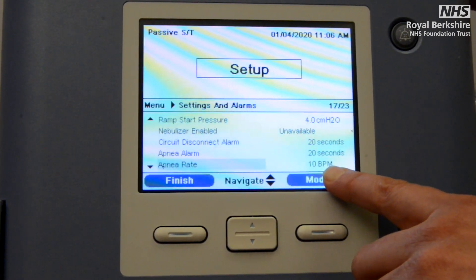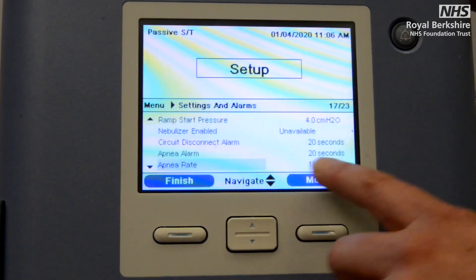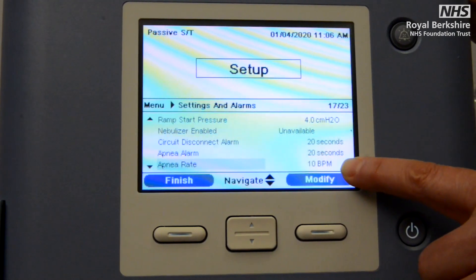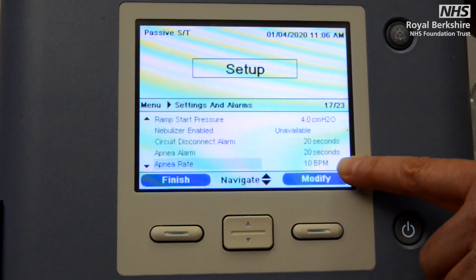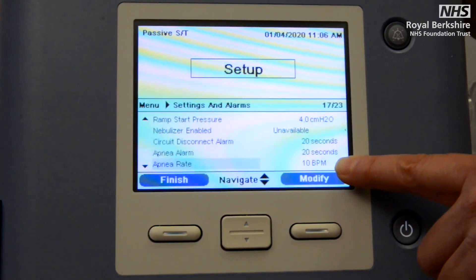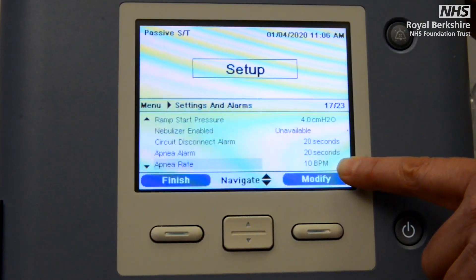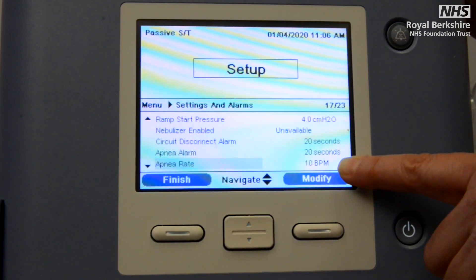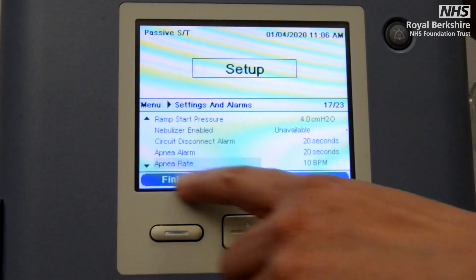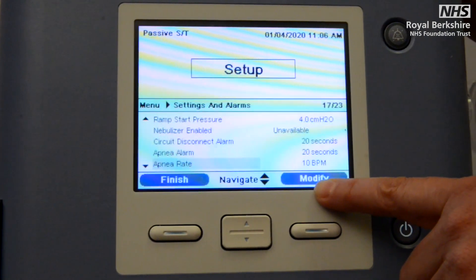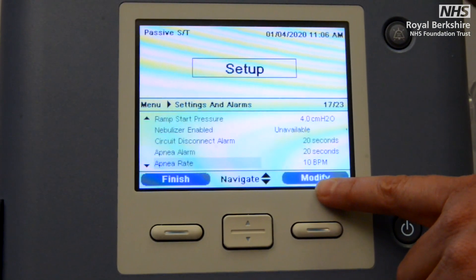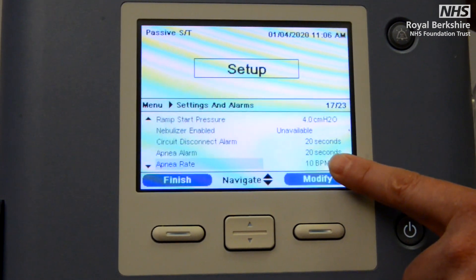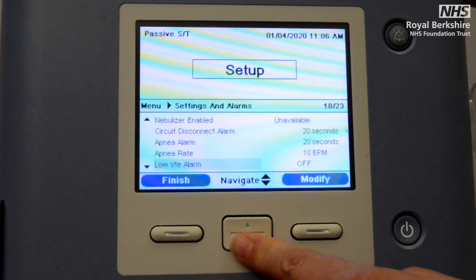The apnea alarm is again 20 seconds as before. The key thing when we're in the spontaneous timed mode is that the apnea rate needs to be set at the same or below what your backup rate is — otherwise the machine will think that the patient is not breathing at all and will start delivering apnea breath rate to the patient. Our backup rate was set at 10, so I'm happy with the apnea rate set at 10.